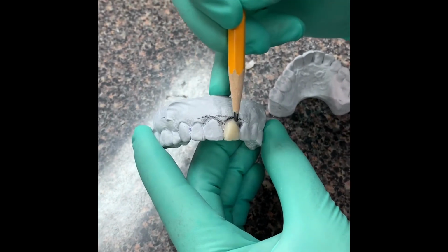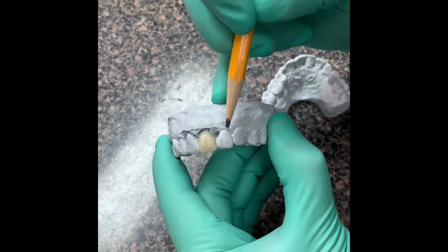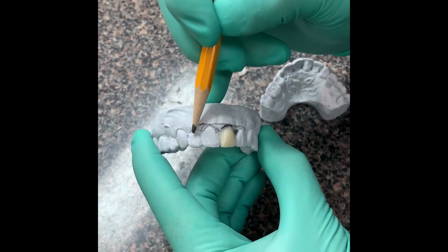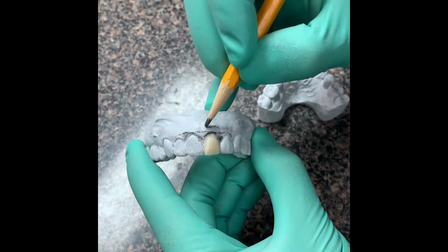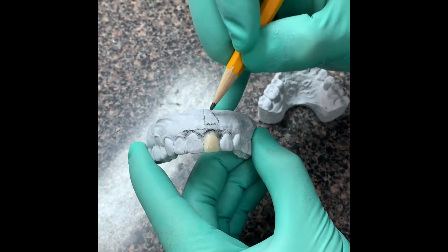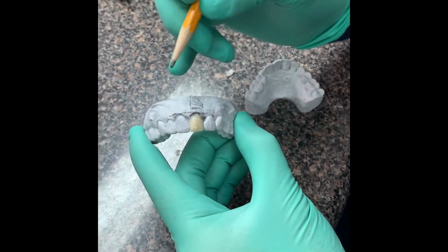We're going to go ahead and do a screw retained provisional, which you guys will see later on of how we make that, and then we're going to come back and do some laser therapy to recontour the tissue and do some nice veneers all the way across. But here today we have to determine how far below the gingival zenith of our final restoration, or the CEJ of our final restoration, the implant's going to reside. And the key answer to that is 4 millimeters.